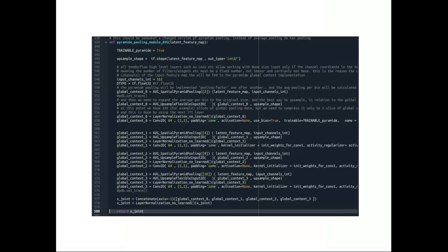And for implementing these principles I just mentioned, we must also supply the model with a global context module. In a pure convolutional model, any computation unit sees only its fixed receptive field around any pixel and is completely oblivious to what's going on in its surroundings. This is highly undesirable, and supplying the model with a global context module is an important way to overcome this limitation.